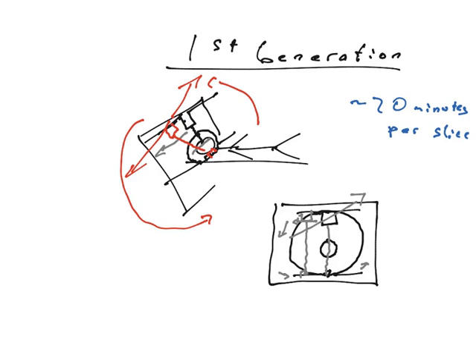if you have, let's say, a sphere, so a solid ball, and you have your X-ray generator sending a beam through, and the detector down here.